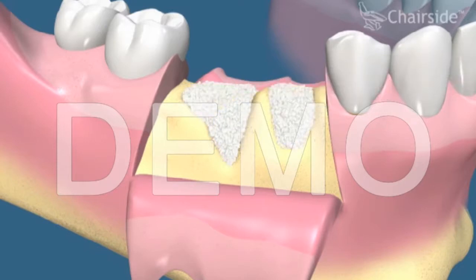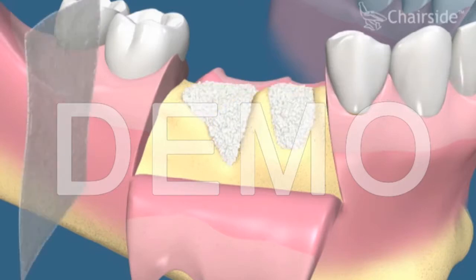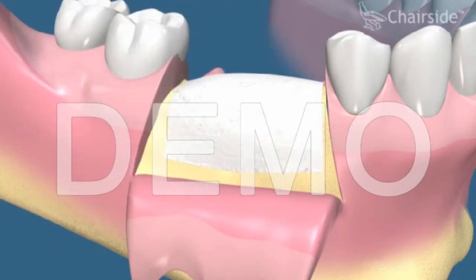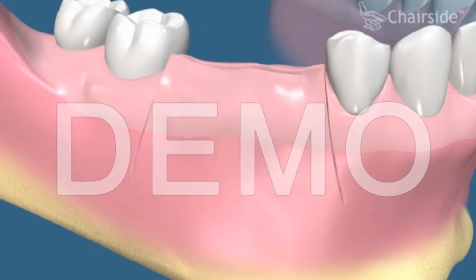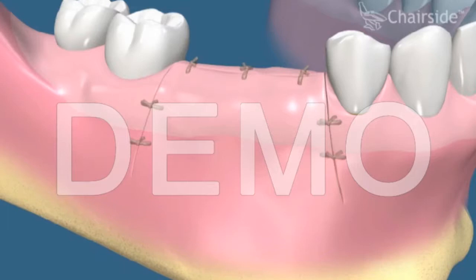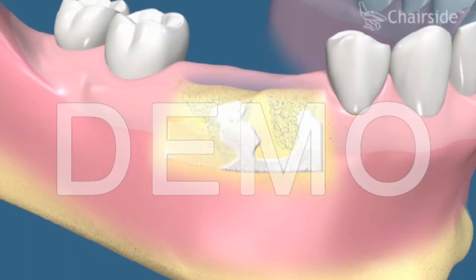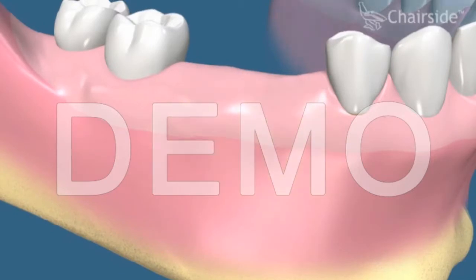These areas can be covered with a resorbable membrane to further aid in the healing process. The flap is then repositioned and allowed to heal. The sutures will be removed or will dissolve if self-dissolving sutures are placed. With time, the membrane underneath the gums will dissolve and the bone substitute will be replaced with the patient's own bone by the body. This treatment will often create an ideal bone ridge in the edentulous area.